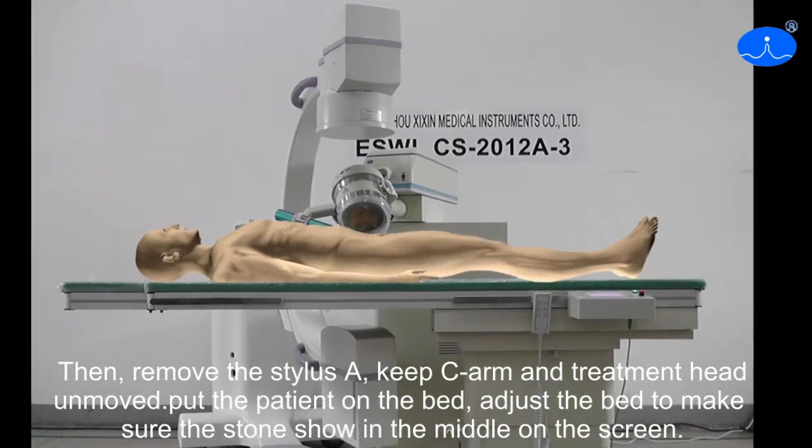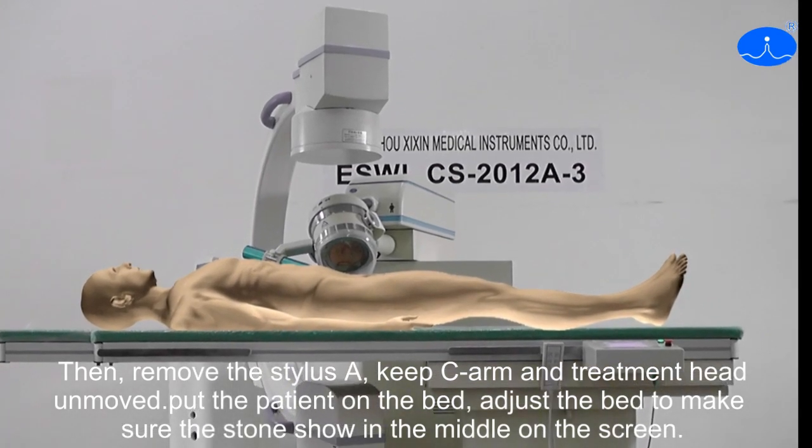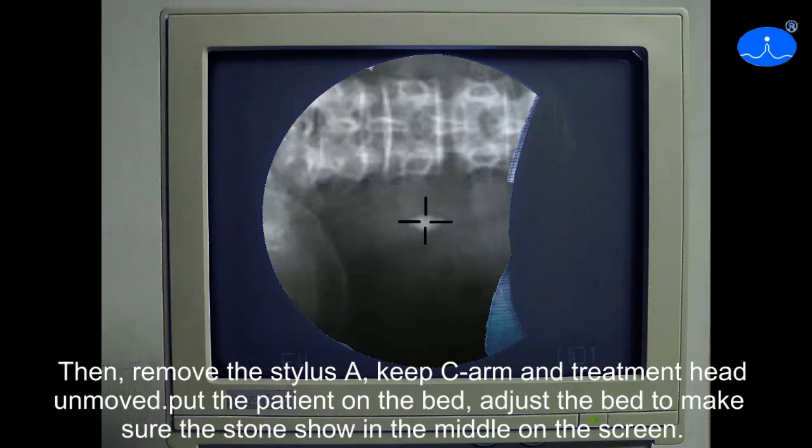Then remove the stylus A. Keep the C-Arms and the treatment head in position. Put the patient on the bed and adjust the bed to make sure the stone shows in the middle of the screen.